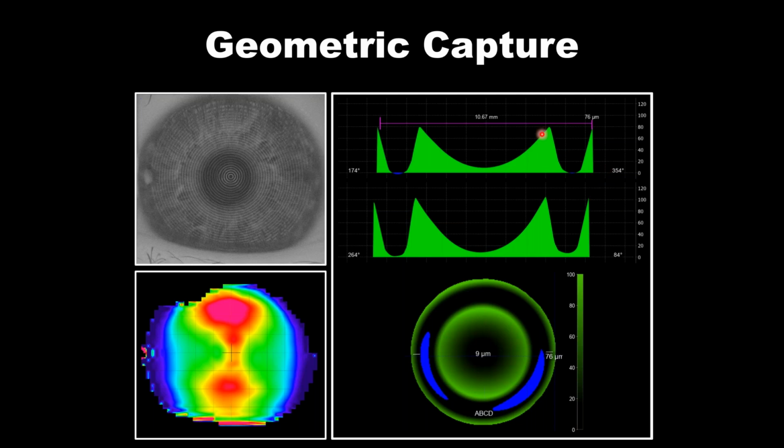We get an even reservoir depth on both sides and an even tear layer depth at the lens edge. Then on the steep meridian, that also gives us the ability to calculate the appropriate depth that will give you that tiny finite little tear layer to allow, in this steep axis, good movement of the lens, good tear exchange, but enough of a relationship, enough depth to better match the surface so the lens doesn't decenter, isn't moving excessively, and wouldn't be uncomfortable.